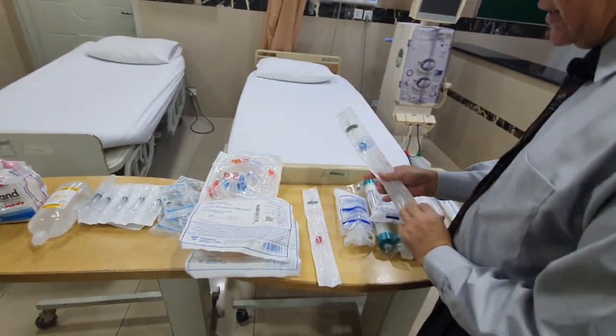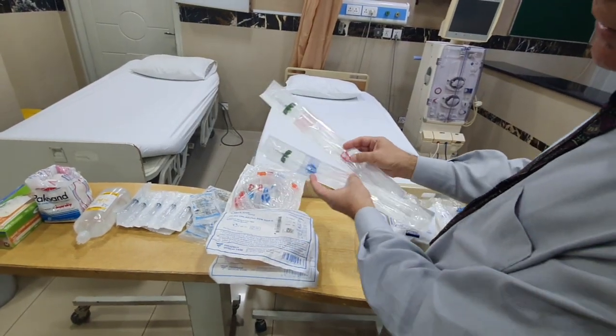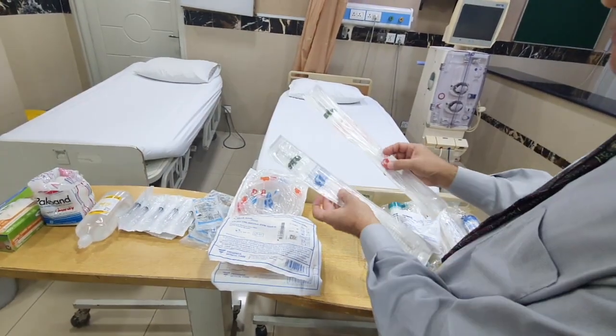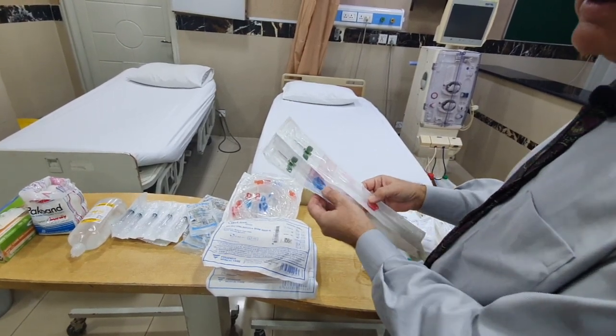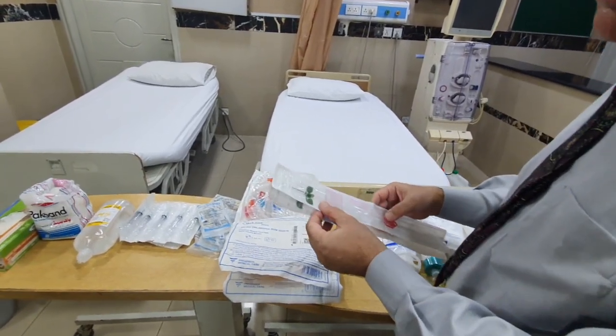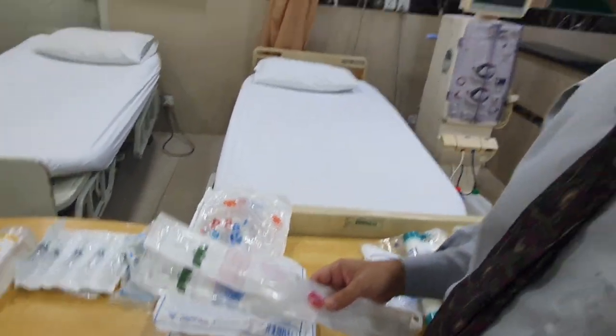Now we've got the fistula needles. The fistula needles are sometimes marked red and blue. The blue stands for venous, the red stands for artery. There are three systems in which red and blue interchange. Normally we know that there is a blue which stands for venous, and there is a red which stands for artery.